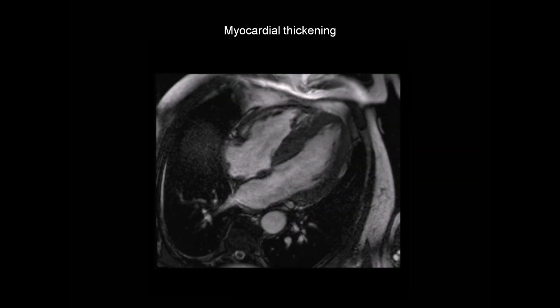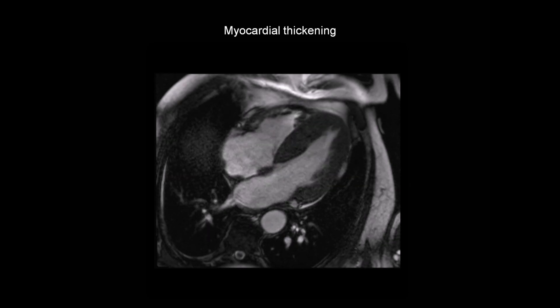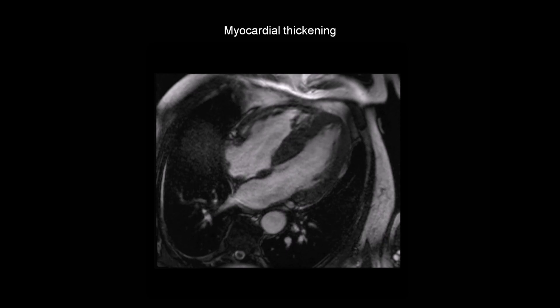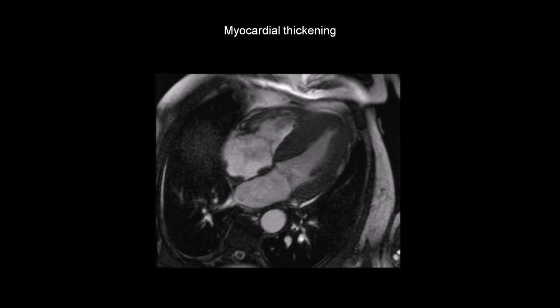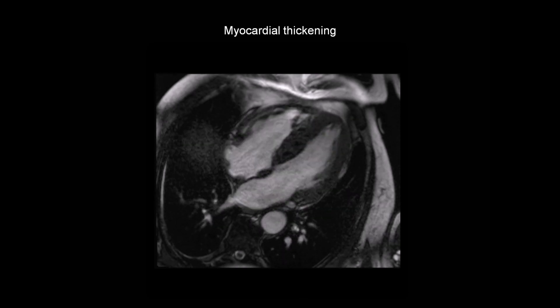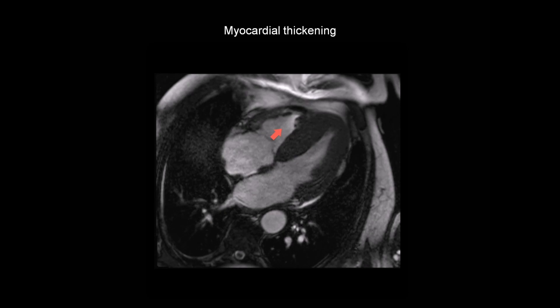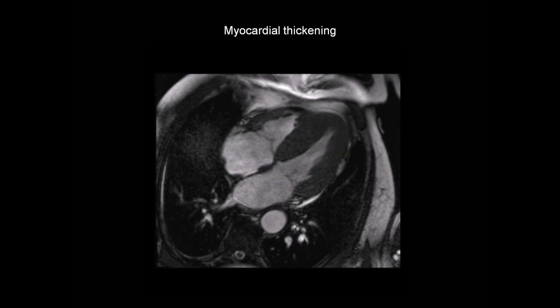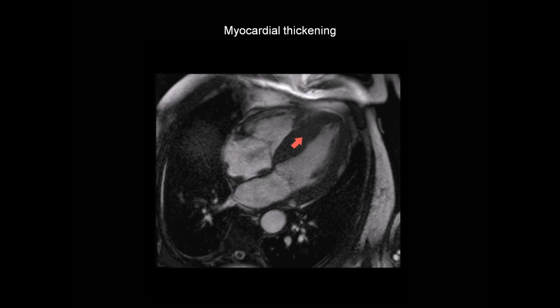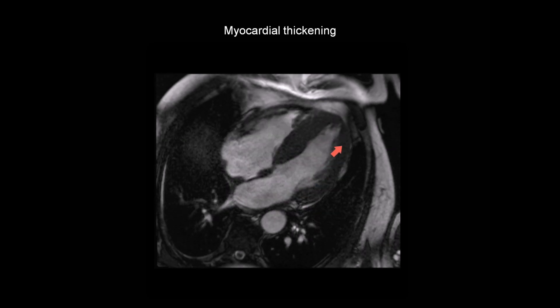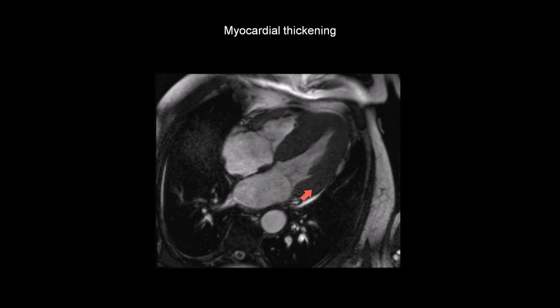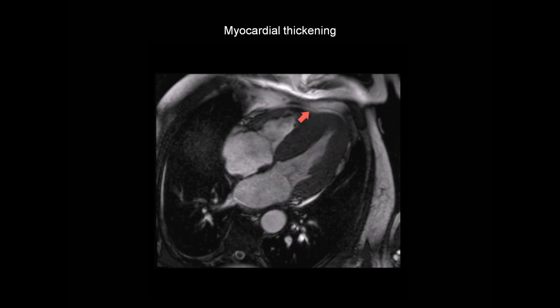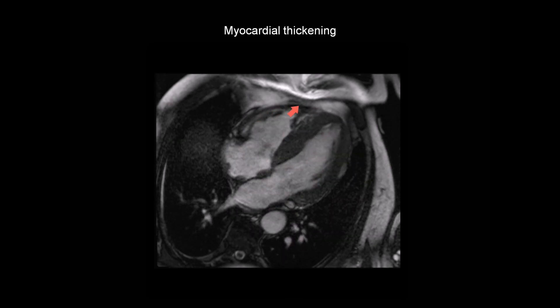Here's another example of myocardial thickening, from an 81-year-old man with cardiac amyloidosis. This shows a cine CMR in the four-chamber view, so we have left and right ventricles and left and right atria. What we see here is marked concentric thickening of the left ventricular myocardium, but also thickening of the right ventricle as well.